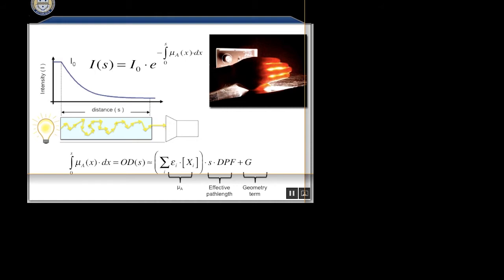There's also what's called the partial volume term, which is of this light going through the tissue, it went in through the skin, skull, CSF, hit the brain, came back out through the CSF, skull, and skin. And the problem is that of that 6 centimeters that it traveled through, only maybe 5 millimeters was actually spent in the region that you actually cared about, the brain.